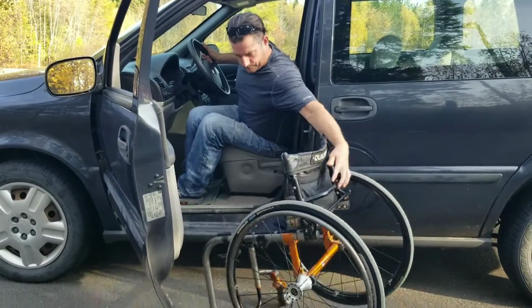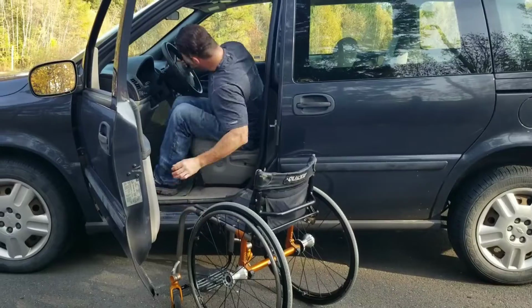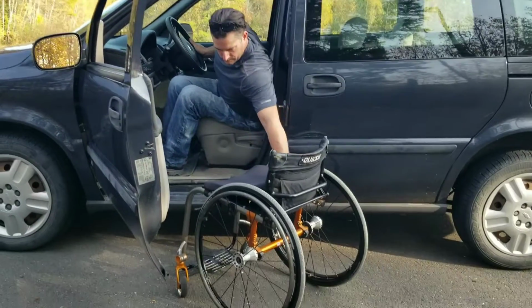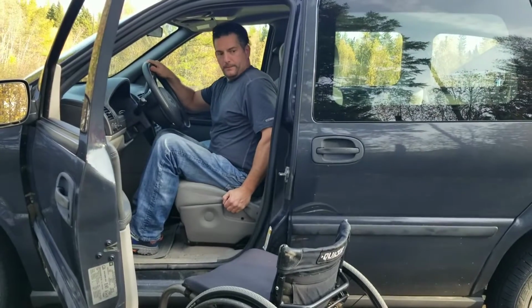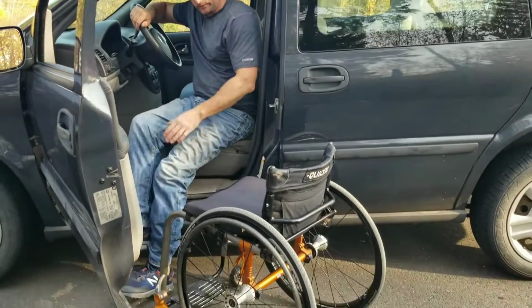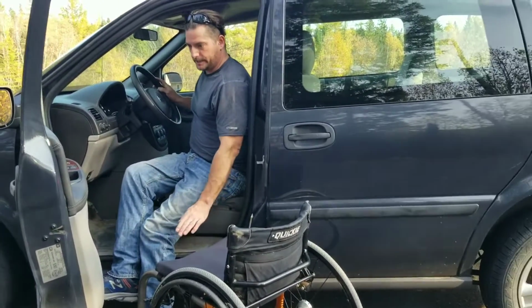Oops, there we go. Now I gotta put my brakes back on. Don't forget to put your brakes on. And need my cushion. Just like that. And again, I'm going to put my back up just a tad bit. My legs out now. To transfer from the car seat to your chair, it's a bit of a drop here, so you got to be kind of careful.